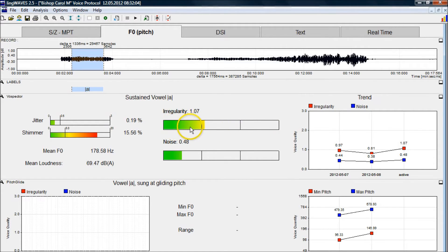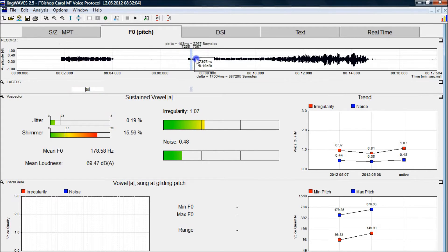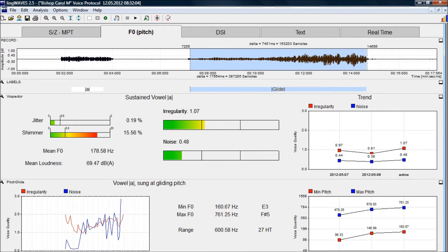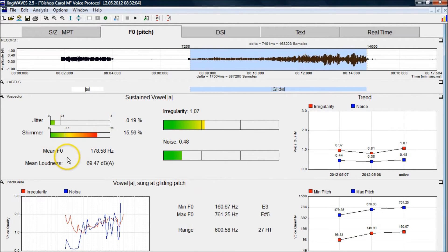The score is out of three and the green colouring shows that I was normal. Now we label the pitch glide. For our DSI measurement on the next screen we need the highest pitch. We label it 'glide' and it will give the pitch range in semitones — 27 semitones — and in hertz — 600 hertz, maximum and minimum. You get your fundamental frequency from the previous measure of R, and it shows a trend with different dates to show progress.